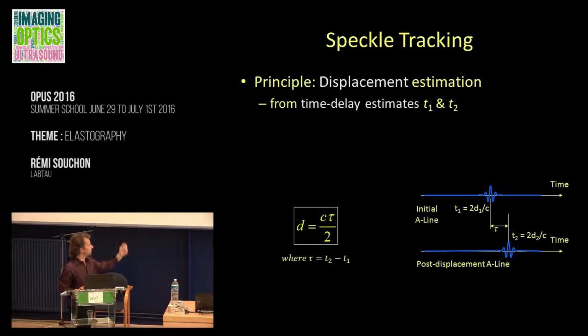Now if I compare the two signals, I can measure the time delay between these two echoes, and this time delay tau, if you do the math, there are the slides that are pretty straightforward, is directly related to the distance. So I can measure this delay tau from my signals, because I get two signals as a function of time. Just by measuring the delay between two signals, I can measure tau, and then knowing tau, I can convert to distance by multiplying by c divided by 2, as we do in ultrasound. So I know the distance for that specific obstacle.